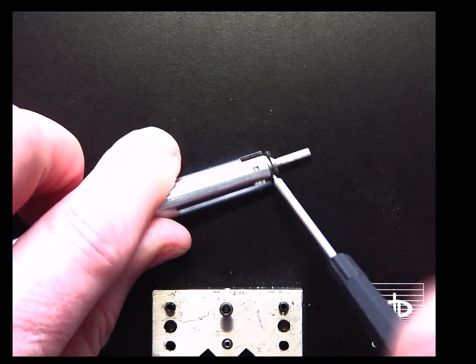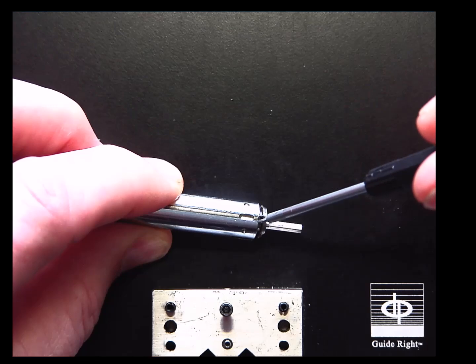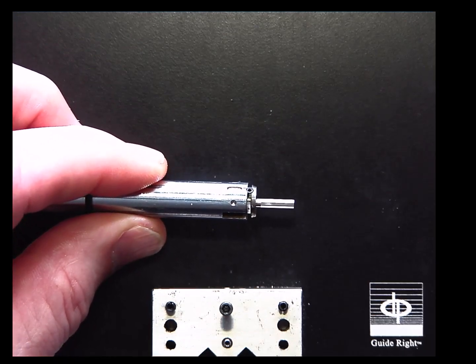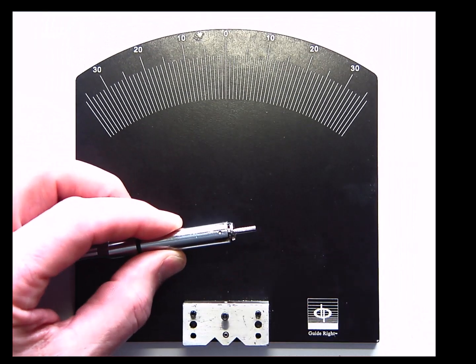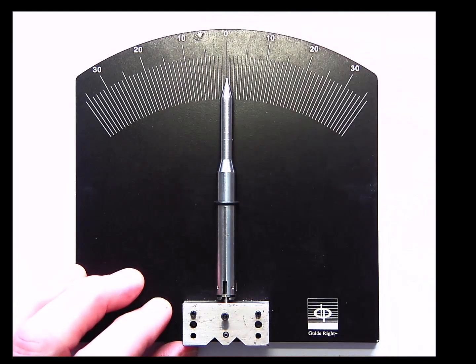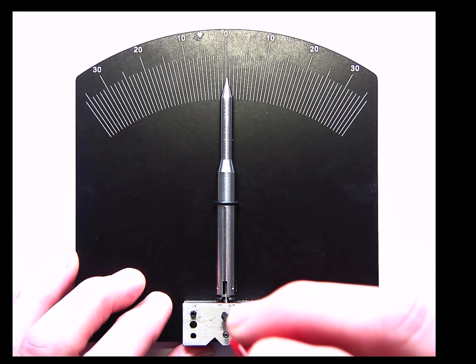The two set screws are tightened with a black and red 0.035-inch hex driver. The guidepost held in the stylus is inserted into the rectangular block of the bending plate. The 5/64 hex driver is used to tighten the cap screw against one of the sides of the guidepost.